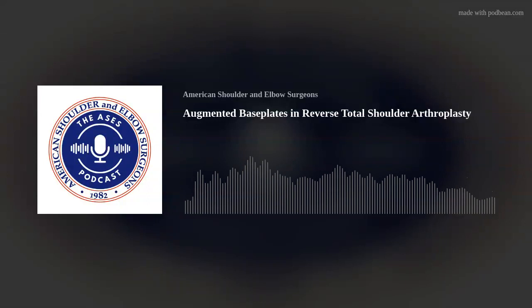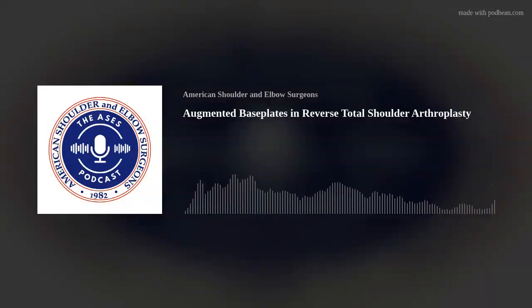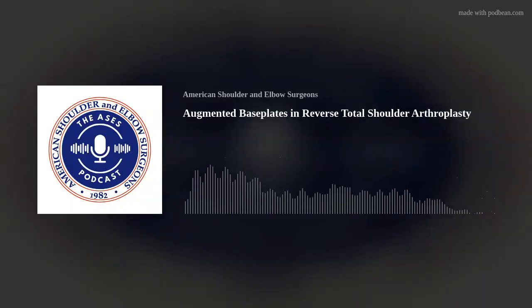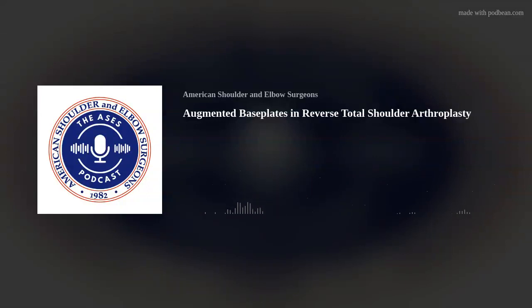Do augments lead to more stress fractures? I don't think we know. There definitely is some thought and some evidence that maybe over lateralizing, and what does that mean on the glenoid side, could increase the risk of stress fracture, or there's a correlation, let's put it that way. But implant factors, actually, in terms of odds ratio, was actually on the lower side of significant things. The number one things are patient factors: being a woman, being osteoporotic, having rotator cuff arthropathy, as opposed to OA.